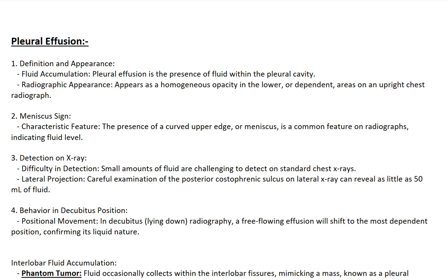Point-wise description of pleural effusion. 1. Definition and appearance. Fluid accumulation. Pleural effusion is the presence of fluid within the pleural cavity. Radiographic appearance. Appears as a homogeneous opacity in the lower or dependent areas on an upright chest radiograph.